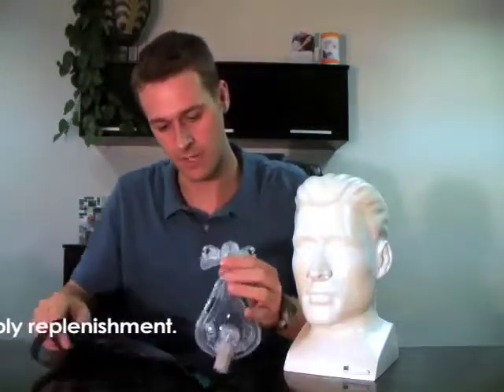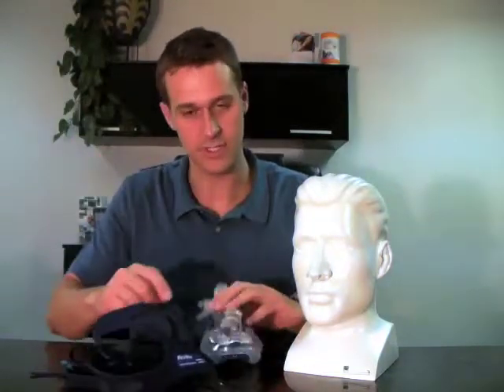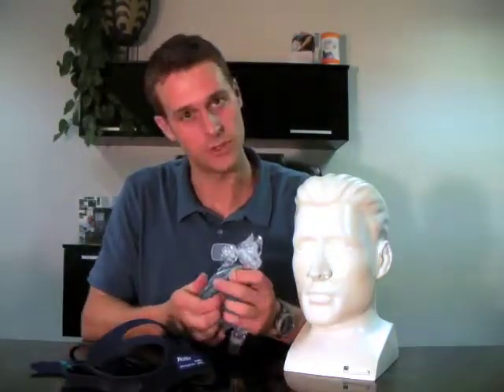The first part of the mask that I want to talk about is the headgear. The headgear is typically replaced every six months by most insurance carriers.